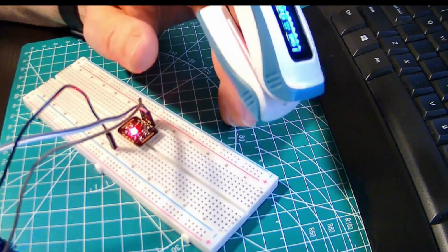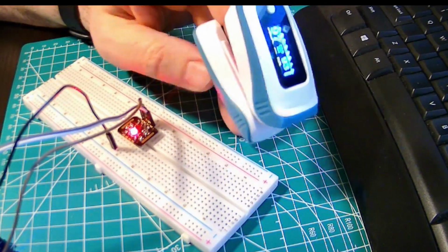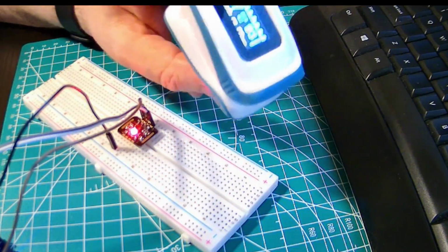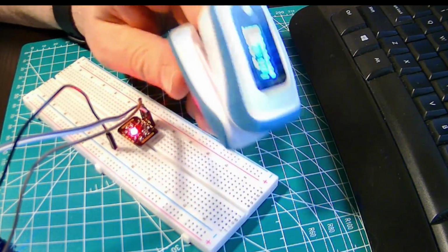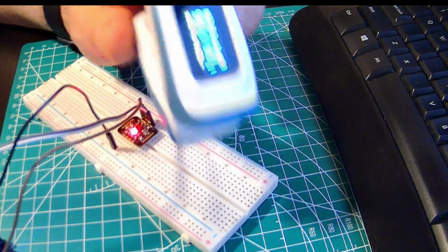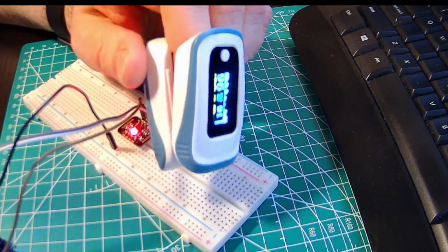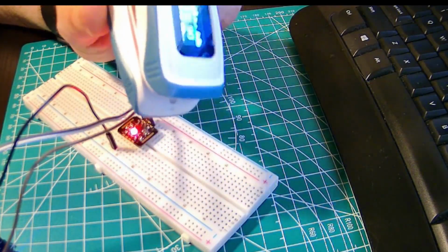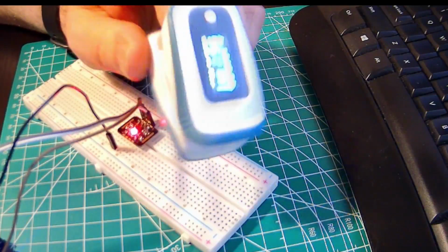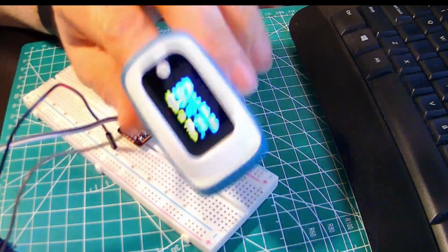To start with, what's a pulse oximeter? Well, it's a device that can be used to monitor oxygen saturation of a person's blood through the skin. That is, it can indirectly measure blood oxygen saturation in a non-invasive way. They can be used to monitor for issues with respiratory function, for example. Now, what's the principle of operation?